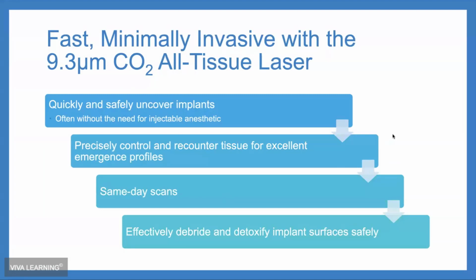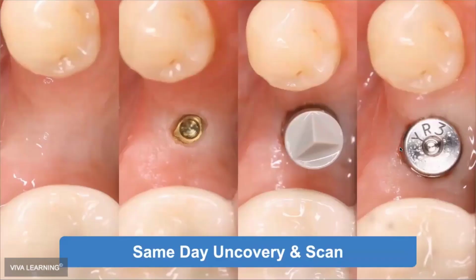I'm not sure of the audience and who might be listening, but in general, a lot of people who are looking at something like an all tissue laser are already doing same day dentistry. They're invested in CEREC or some other digital scanner, and their goal is to make the patient's life easier. They're trying to get same day scans done and get crowns to seat in the fewest appointments possible. The laser is certainly an adjunctive tool to what you're already doing with your digital scanners.